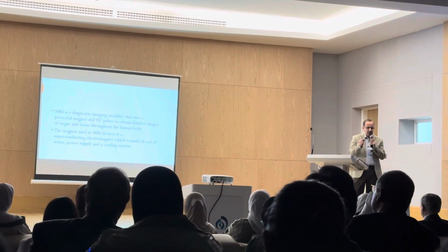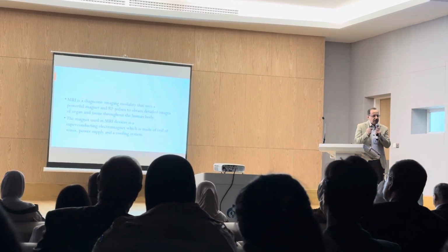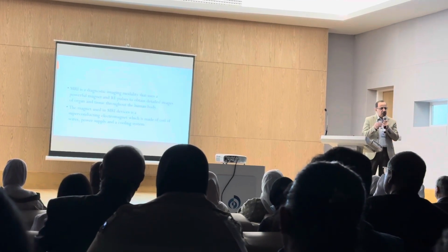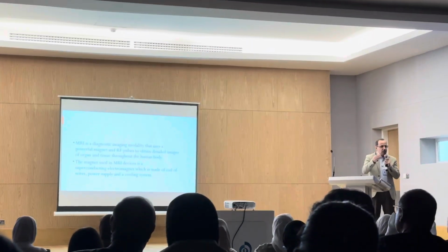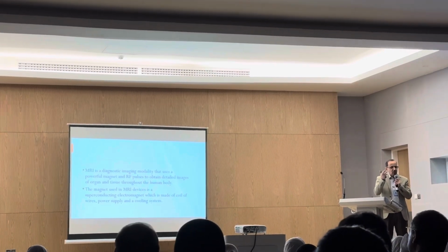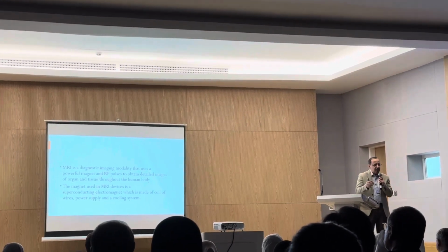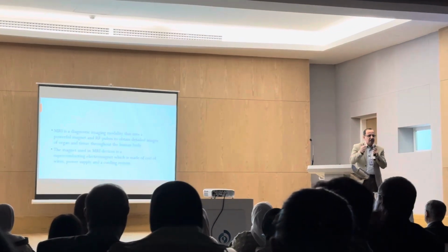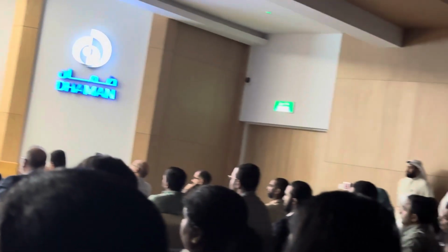What is the meaning of superconducting wires? These are wires made of material that, when exposed to a very low temperature, the critical cryogenic temperature, will go into a state of superconduction, supporting the passage of high-intensity electrical current without resistance, without heat, and without loss of energy. This means we obtain a closed-circuit electrical current which will last for years without change or alteration, and we can even separate the power supply from it.